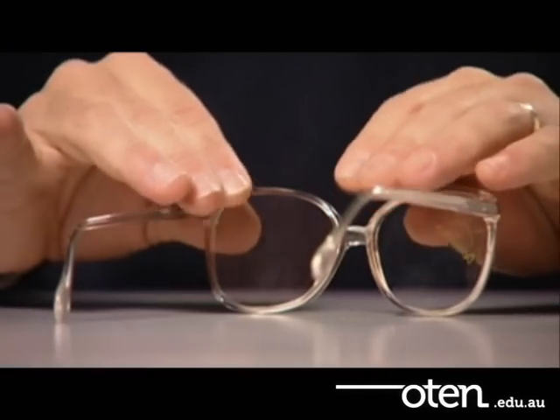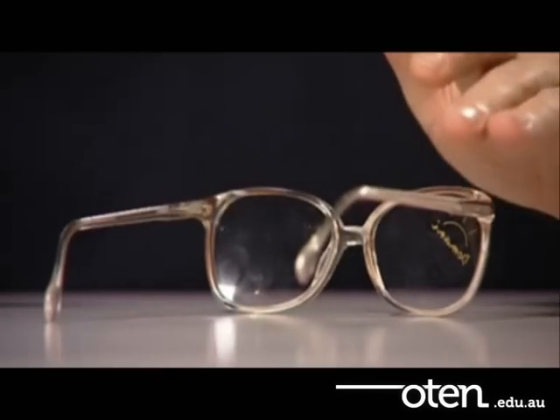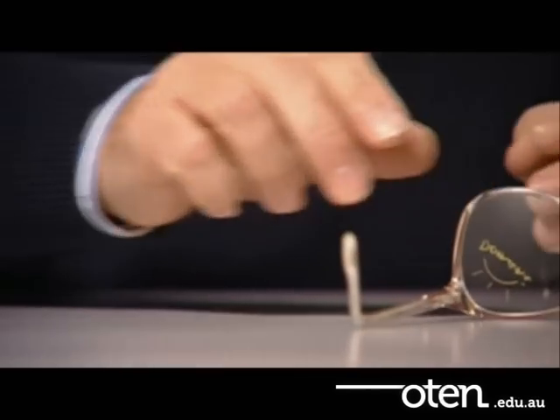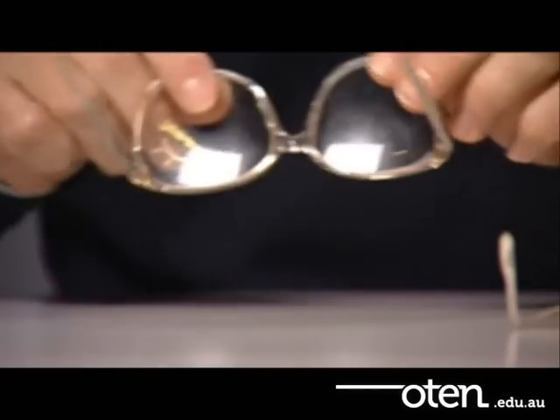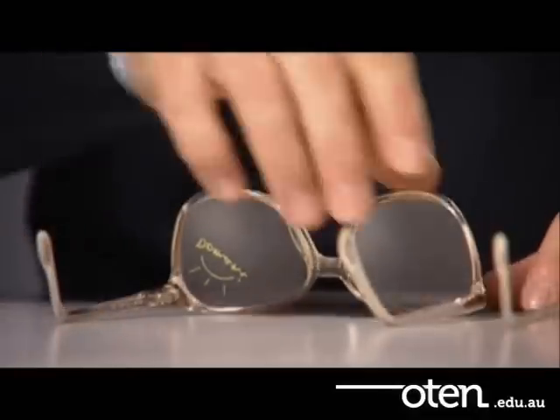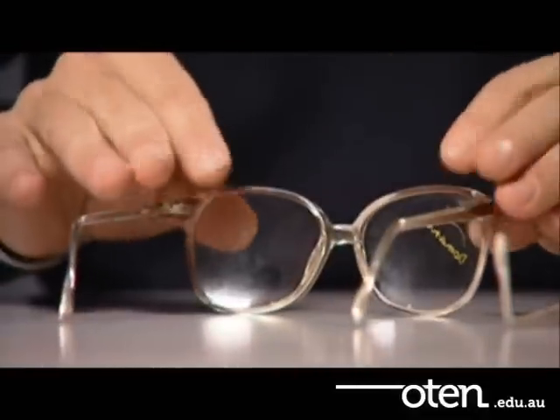To check if the temples are parallel and at the correct angle down, see if they rest evenly on a flat surface. If correctly aligned, the frame front and open temples will both touch the flat surface evenly, causing a four-point touch.